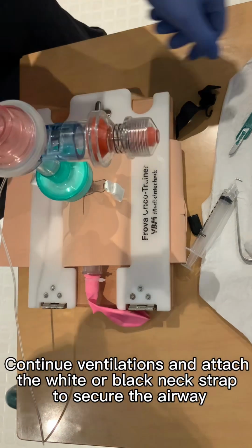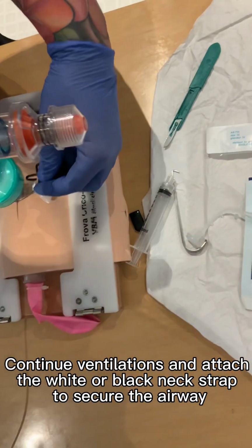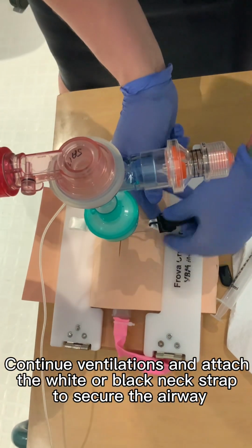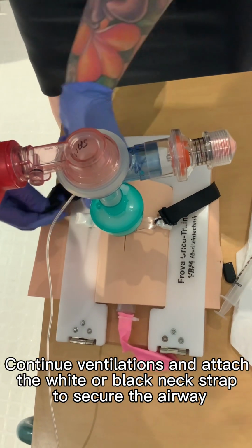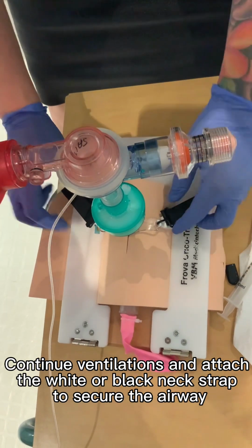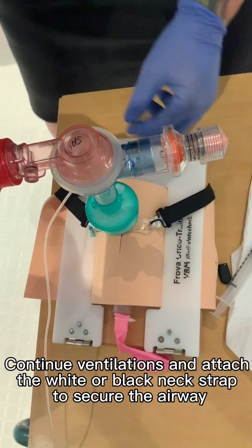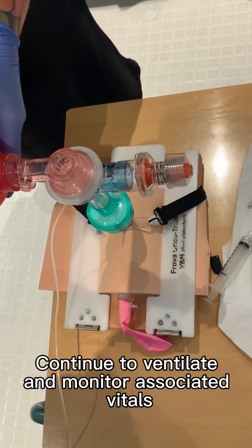Once you have confirmed the surgical airway, continue ventilations and attach the white or black neck strap to secure the airway in place. Continuously monitor vital signs and continue to ventilate.